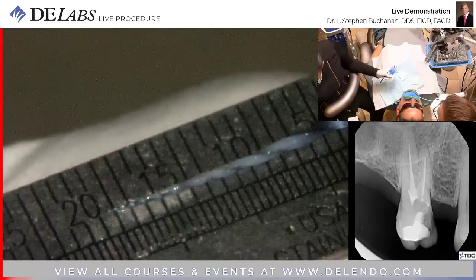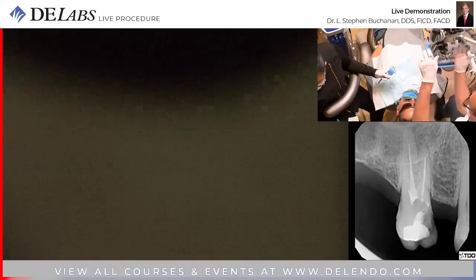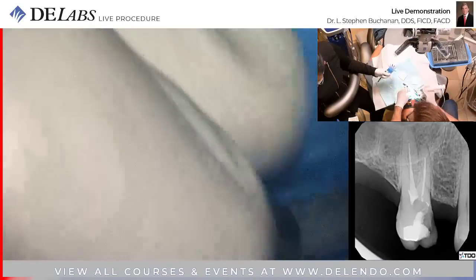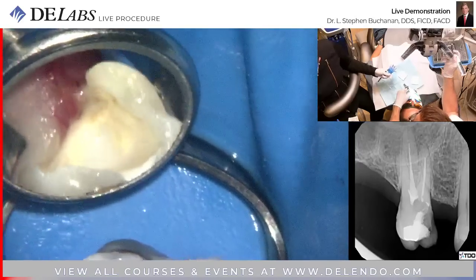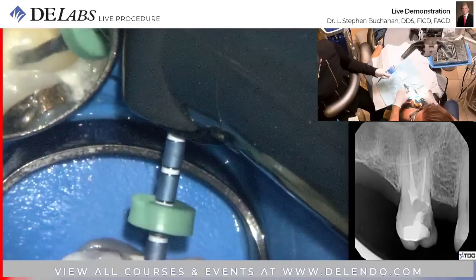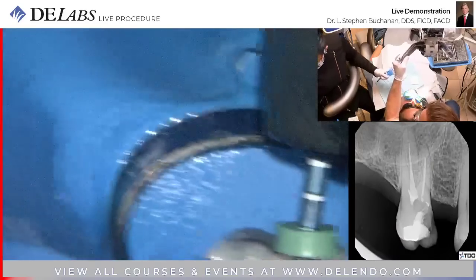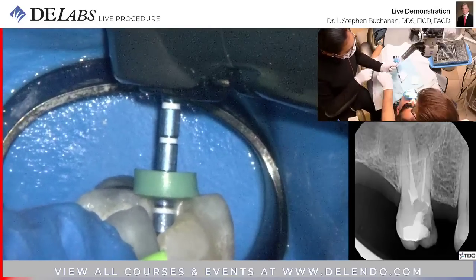This is the MB1. We're at 18.5 millimeters. The only one I don't reference to the palatal cusp tip is the mesiobuccal 1. Mesiobuccal 2 I reference to the palatal cusp tip because it's a triangular shaped root. It's going to naturally have the handle over that area. And I put that little notch in there so I could find this thing. Here we go. This is the first time I've used it as rotary negotiation. This is the only canal that wasn't negotiated before, and I've just gotten to length with essentially a single cut. See that?